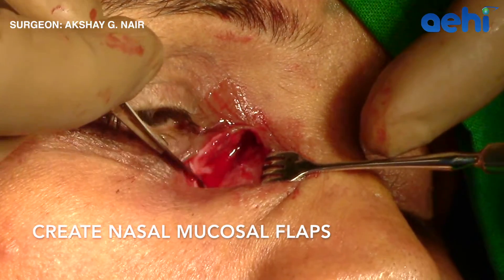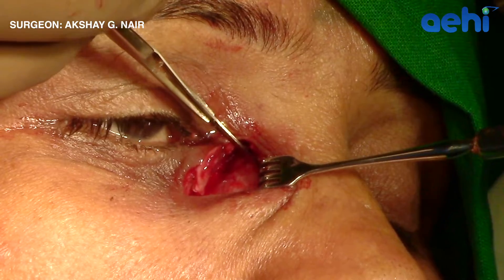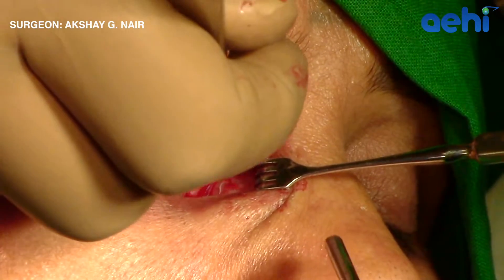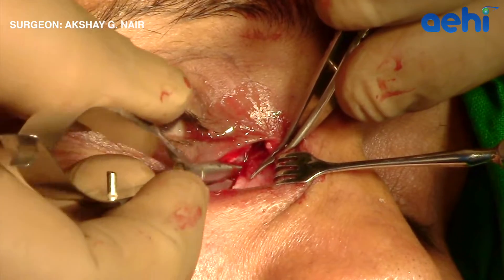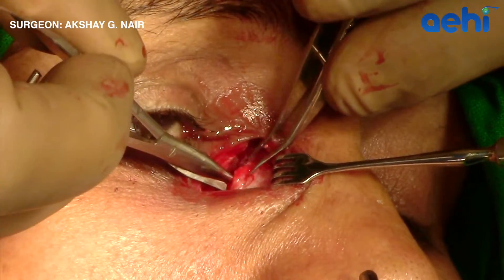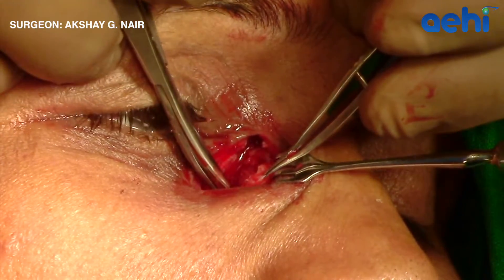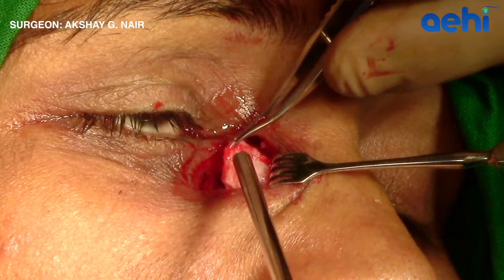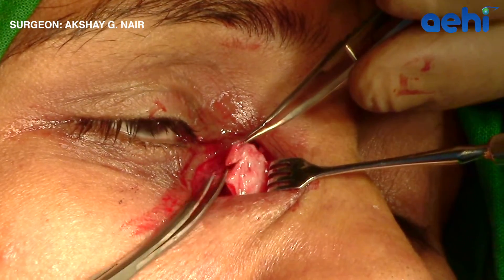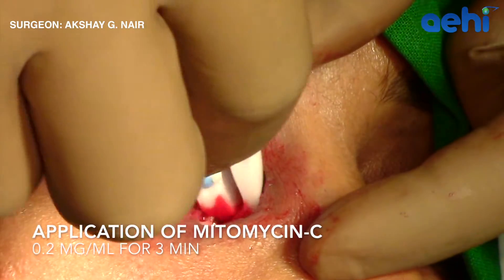After this, the nasal mucosal flaps are created in a similar fashion. Two linear incisions are made and, using a pair of scissors, the incisions are joined to create a U-shaped flap. I prefer to make only anterior flaps for both the nasal mucosa as well as the lacrimal sac. The posterior edges of the mucosa can be left alone or cut. Here, the nasal mucosal flap has been trimmed.